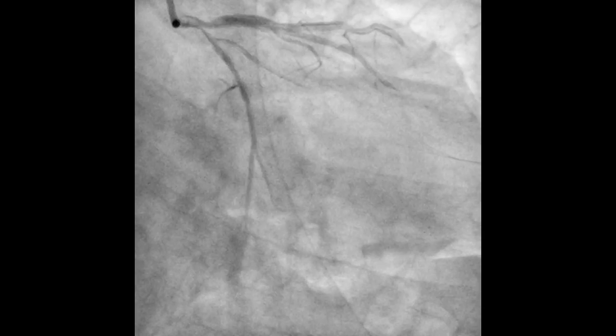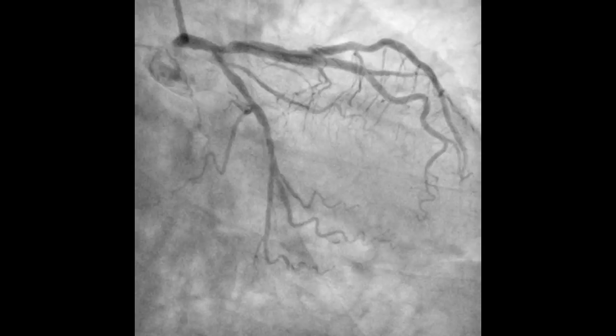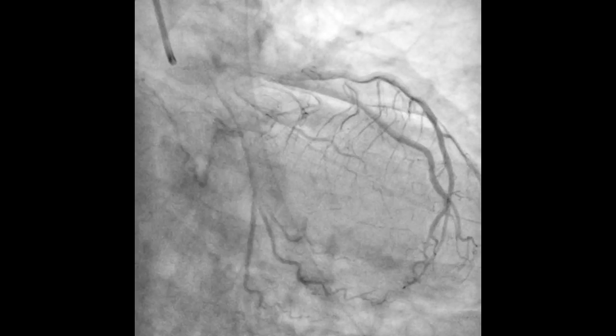Here's another side view. The LCX is at the bottom. The arteries look kind of thin because they're injecting media into it.